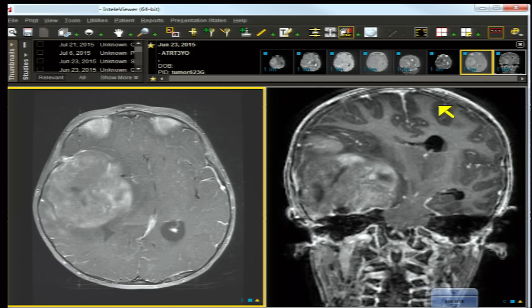On spectroscopy MRI, the choline level is elevated, the lactate-lipid peak is elevated, and NAA — a neuronal marker — is low or absent.